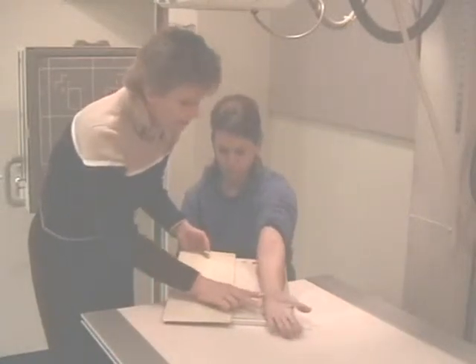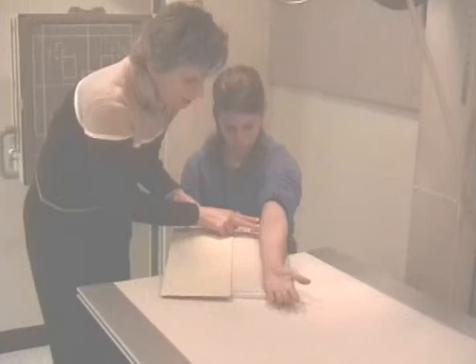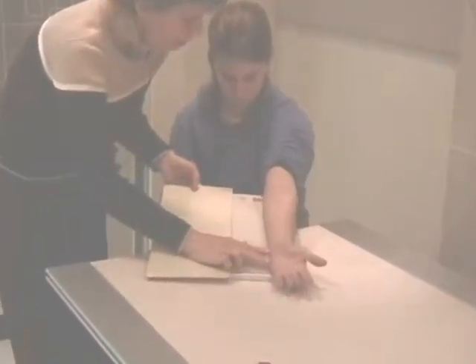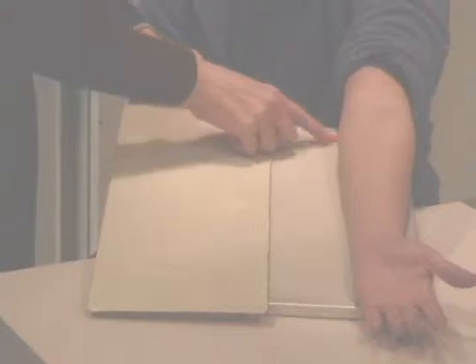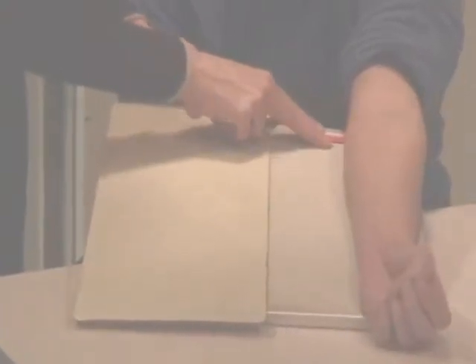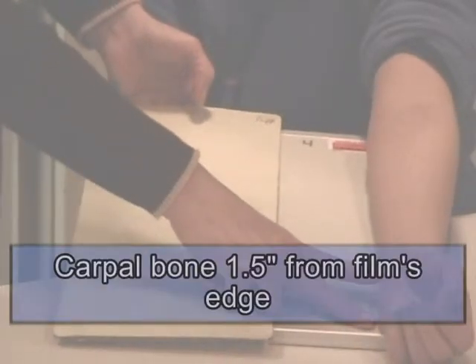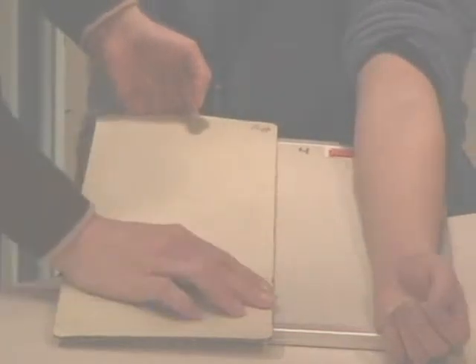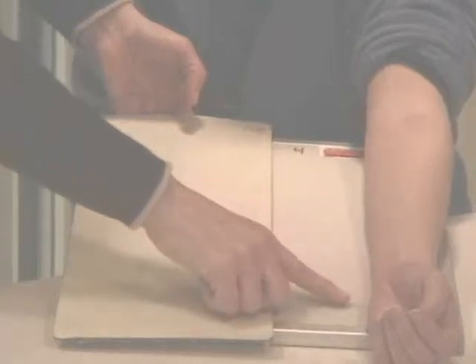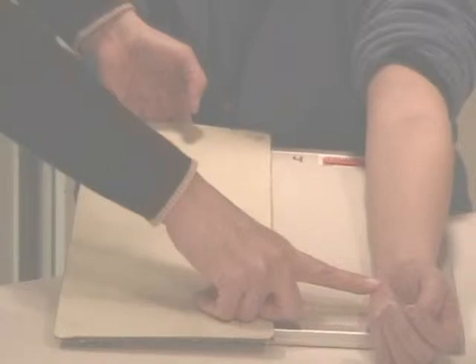When I look at this, I see the carpal bones. There's 2 inches. I see the ID blocker more like 1 inch. So I need to move her arm down, and now I think you can see that the joint spaces are going to be equally distributed, and the relationship is the same from the ID blocker to the film's edge here. So I make the mental note that the carpal bones will be about 1.5 inches from the film's edge on this particular patient. Somebody with a longer forearm, the carpal bones are actually going to be 1 inch from the film's edge. Do not go closer than 1 inch from the film's edge.